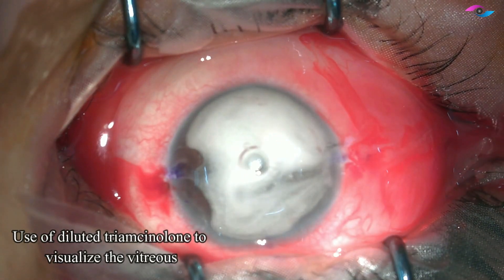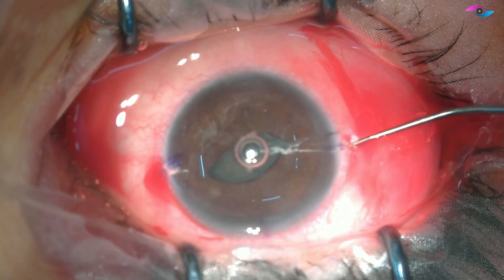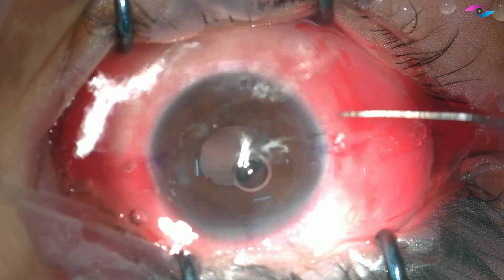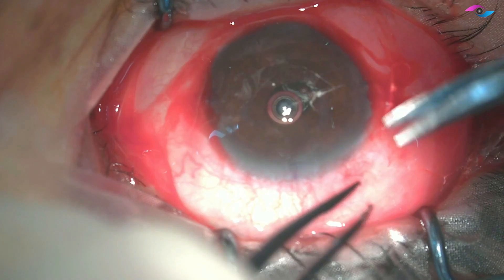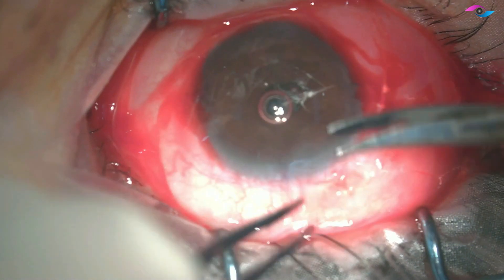After injecting pilocarpine to constrict the pupil, we are using dilute triamcinolone to visualize the vitreous in the anterior chamber. A good vitrectomy is a must before inserting these iris claw IOLs, so I am taking all the vitreous tags and making sure that there is nothing coming out of the side ports.